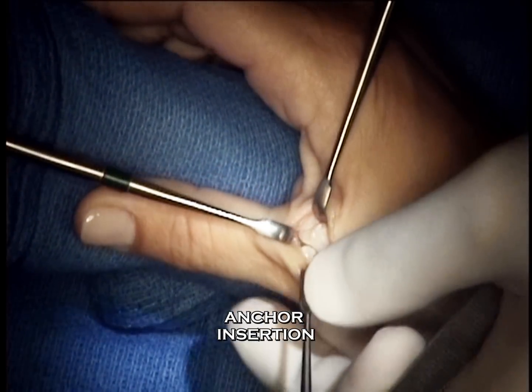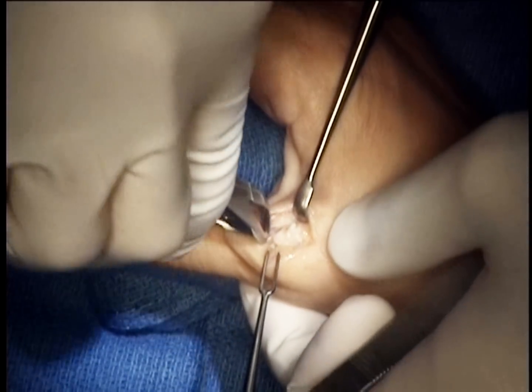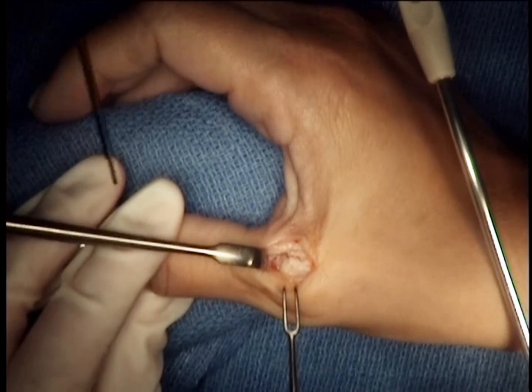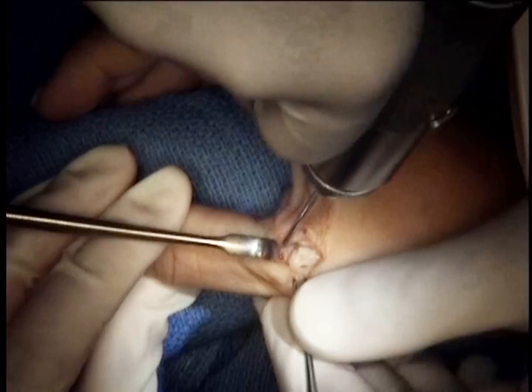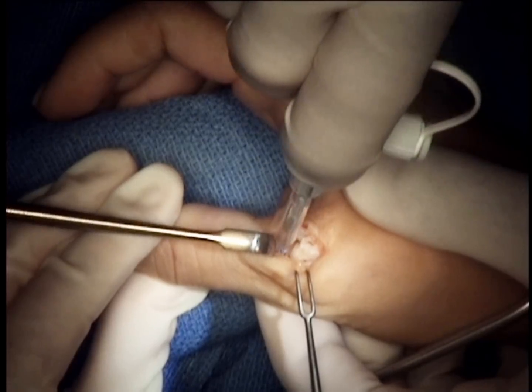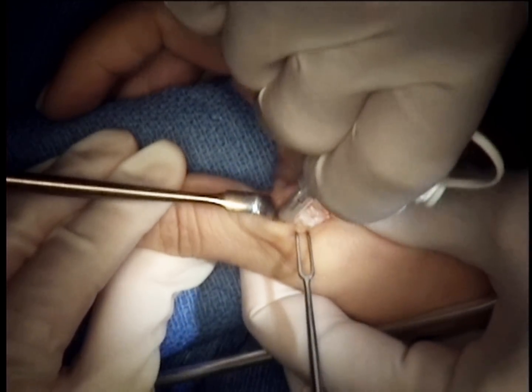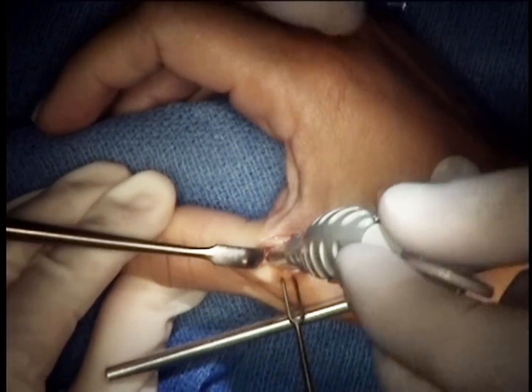A rongeur is used to make a trough in the base of the proximal phalanx where we will reattach the ligament at its insertion site with an anchor. In this case, we used a suture-type anchor which has no metal implants and allows for resorption over time, but plays the role of reattaching the ligament without needing to create drill holes or tie it over a button.